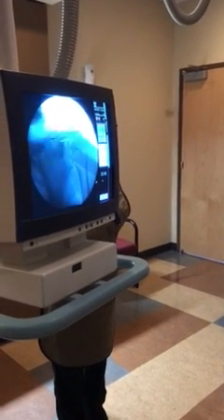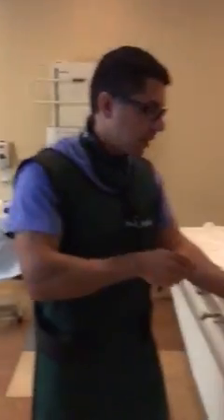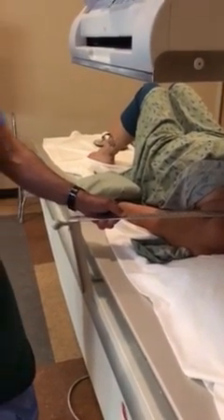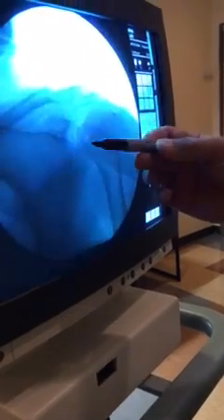We're going to show you the procedure of doing a shoulder arthrogram. I'm going to be on the left shoulder here on this patient. We get the patient in position supine with her left arm supinated, so the palm is towards the ceiling — that opens up the joint space. On the x-ray, we want to put that glenohumeral joint, the top part of the glenohumeral joint, right in the center of the imaging intensifier.